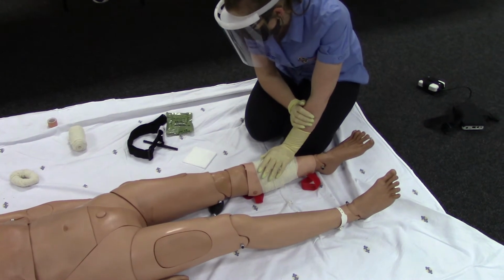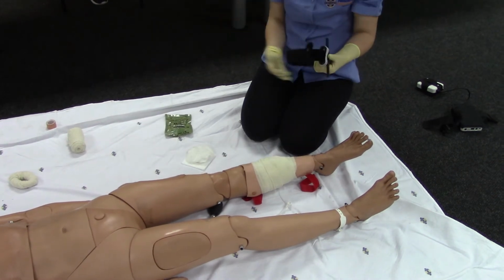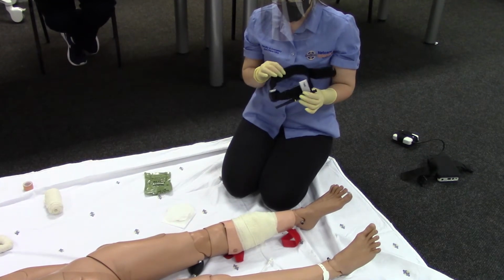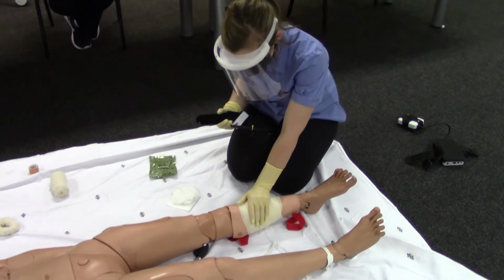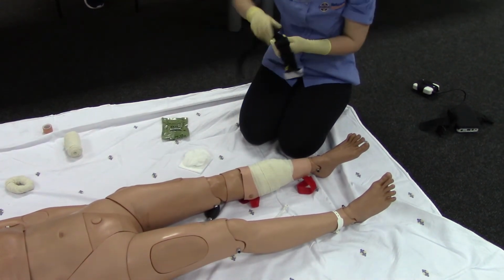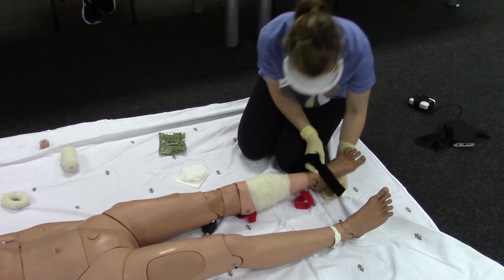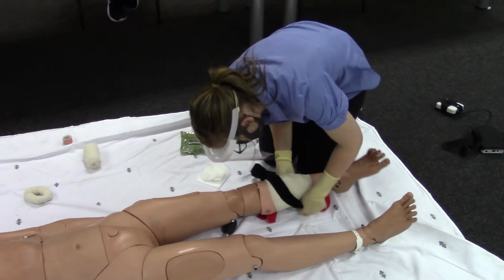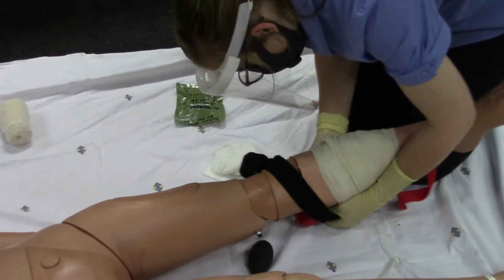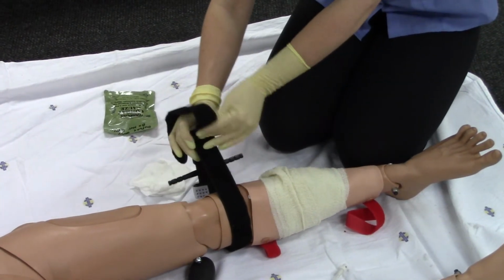Step 4. Application of a commercial tourniquet. If the bleeding cannot be controlled by direct pressure and dressing, apply a commercial tourniquet. Hold pressure over the bleeding site and place the tourniquet just above the injury. The tourniquet should be placed 5 to 6 centimeters above the injury.